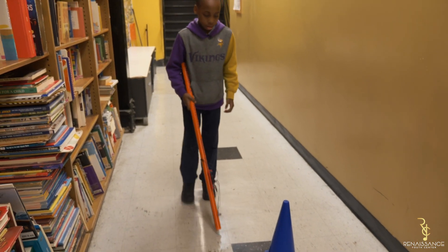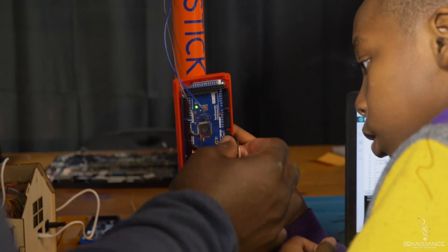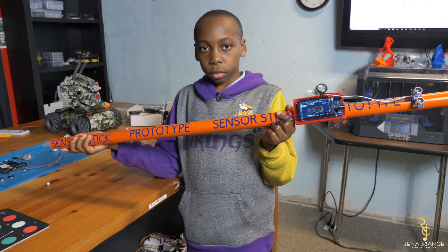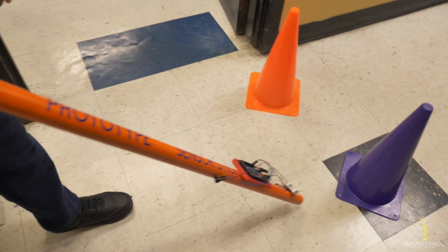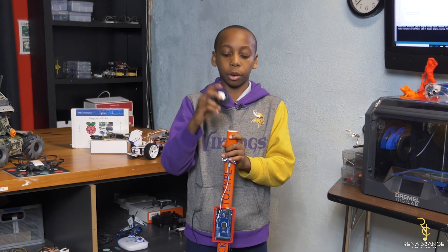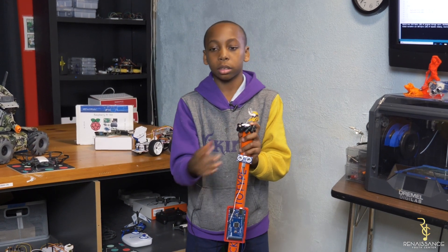What I would do differently is make it less heavy, because you don't want to make your arms hurt while holding it. The second thing I would do differently is add a wheel so you could just roll it instead of tapping the ground.